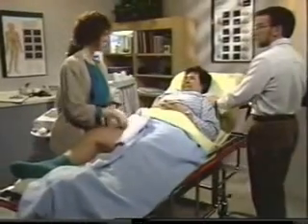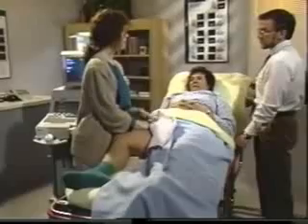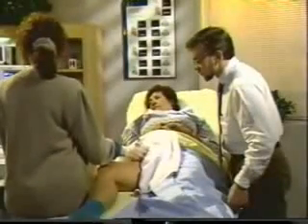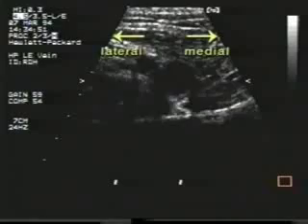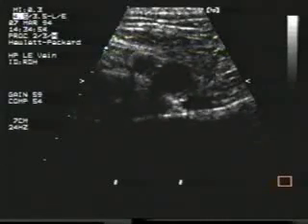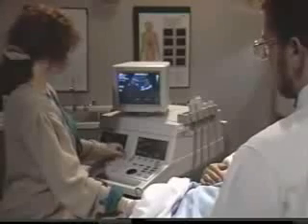To begin the lower extremity examination, elevate the patient's head at least 15 degrees in the reverse Trendelenburg position. For most adult lower extremities, you will probably need a 4 or 5 megahertz linear transducer. In this lab, they use the transverse orientation to get a quick overview of the vessels, though some labs start with a longitudinal plane. To begin transversely, position the transducer in a transverse orientation at the groin. Always take the time to optimize the B-mode image.